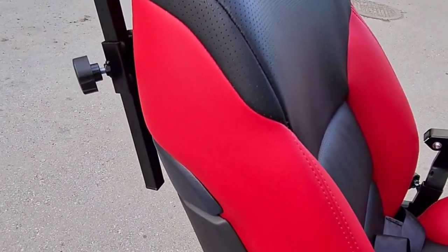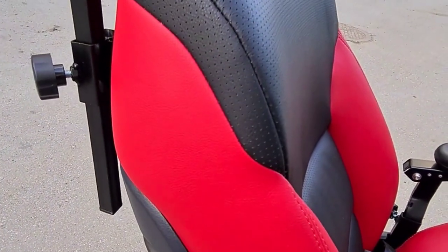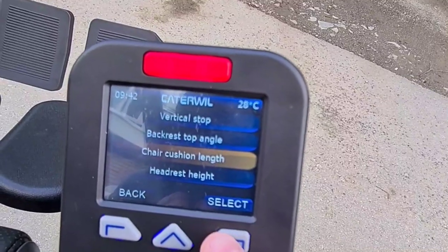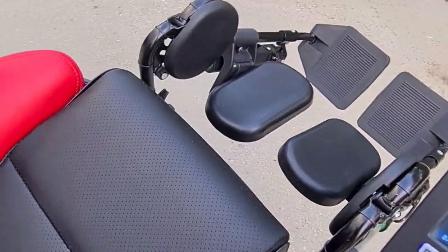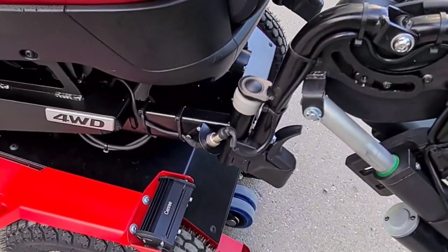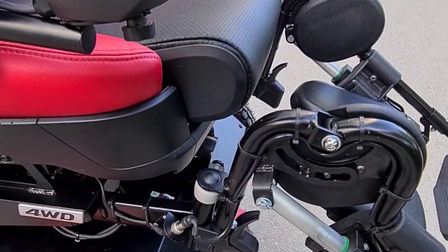Backrest top angle. And then chair cushion length — see this. The length is adjustable.